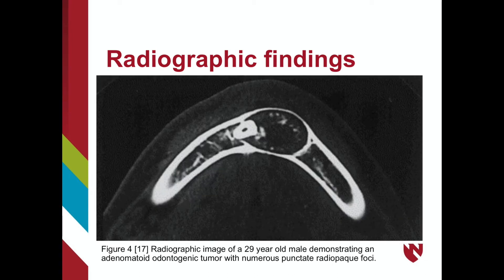In this computed tomography image of a 29-year-old male with an adenomatoid odontogenic tumor, numerous punctate radiopaque foci are arranged circularly at a specific distance from the margin. The buccal-lingual cortex are expanded slightly and thinned by the lesion as well.